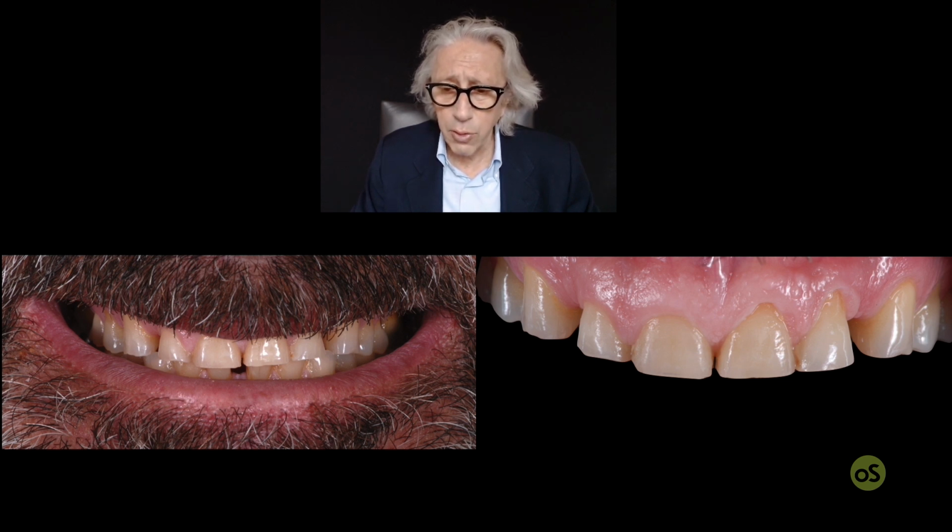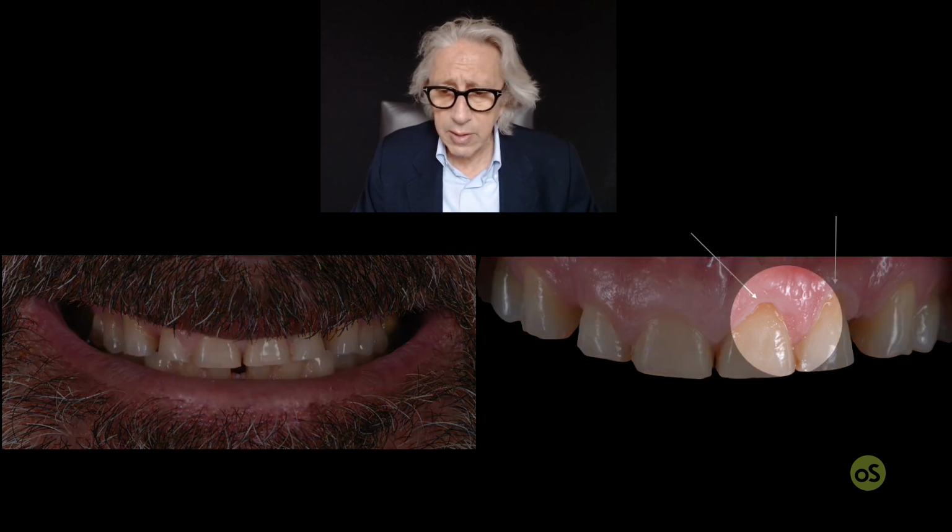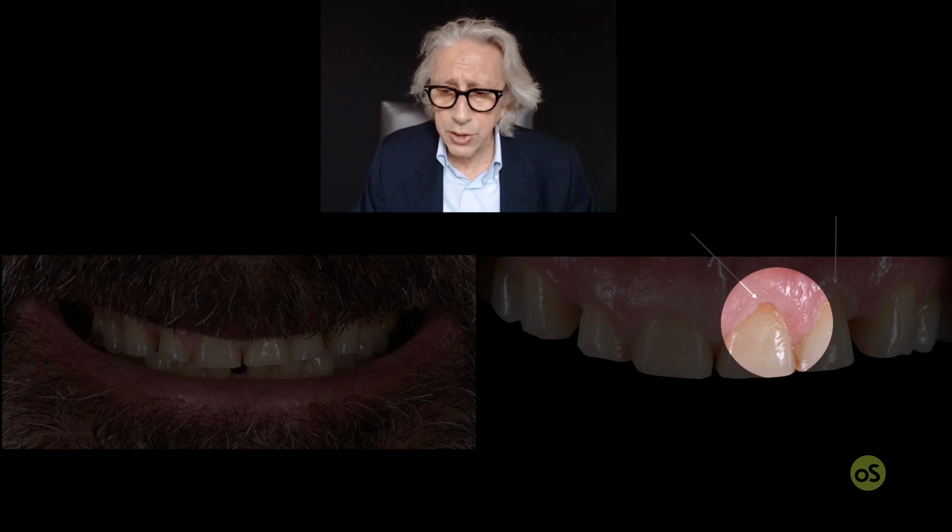So very small teeth. But more than that, I would like to stress one point. We have a kind of recession on the left central incisor and left lateral incisor on the upper arch. The recession can in some way be fixed with periodontal treatment, of course, covering the roots. But the patient didn't want this because you have to wait for soft tissue healing and maturation. You want to finalize the case immediately, if possible. So we can decide on another option: to keep this situation in place and finalize your preparations on the CEJ, not arriving up to the gingival outline.